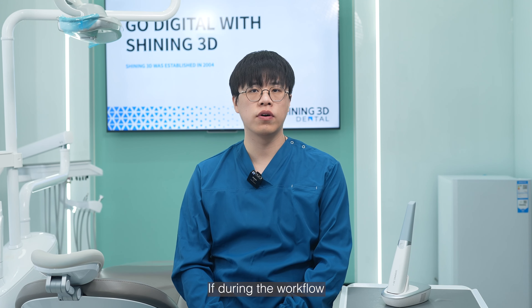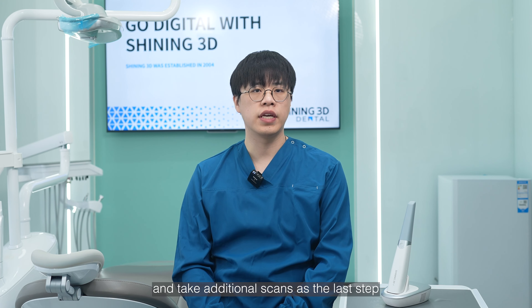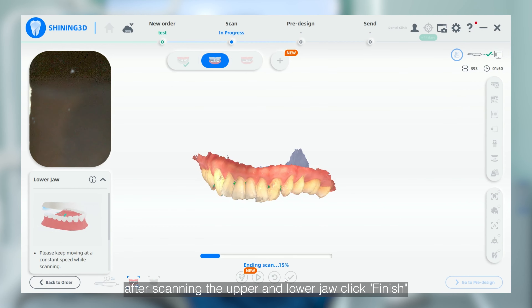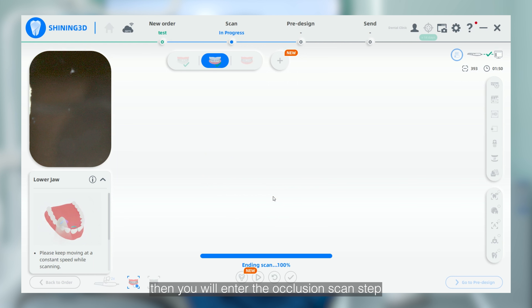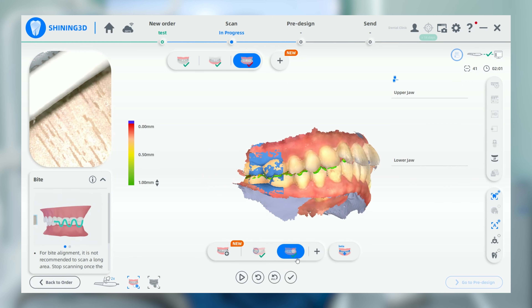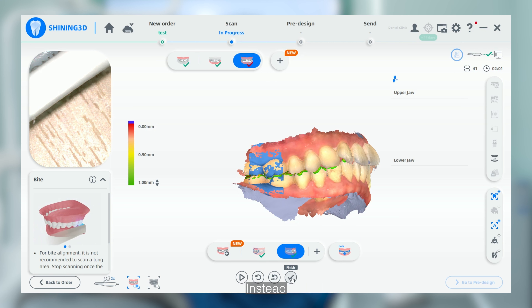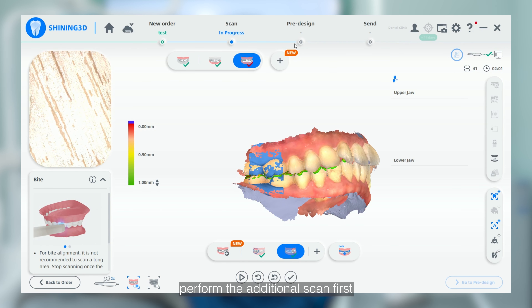If, during the workflow, you scan the upper jaw, lower jaw, and bite, and take additional scans as the last step, here is a reminder to ensure a smooth workflow. After scanning the upper and lower jaw, click Finish, then you will enter the occlusion scan step. After capturing the occlusion, do not click the Finish button. Instead, perform the additional scan first.